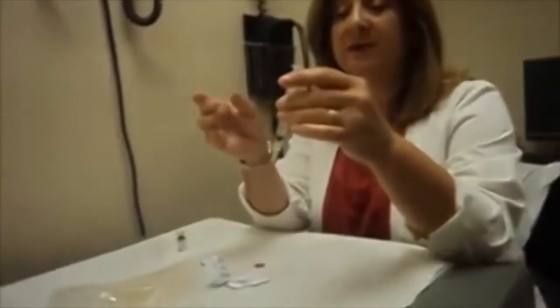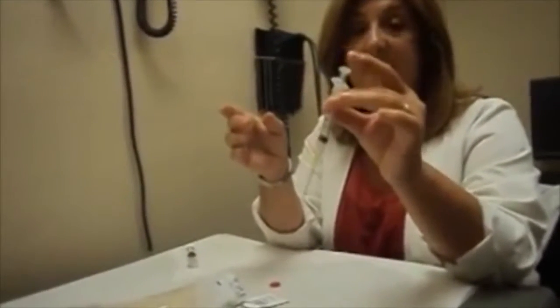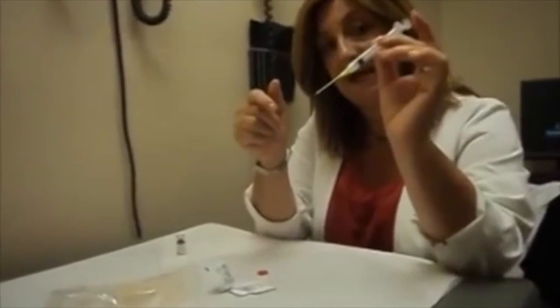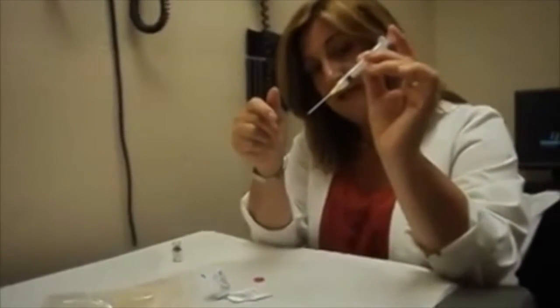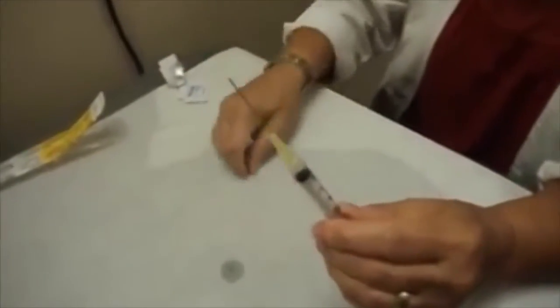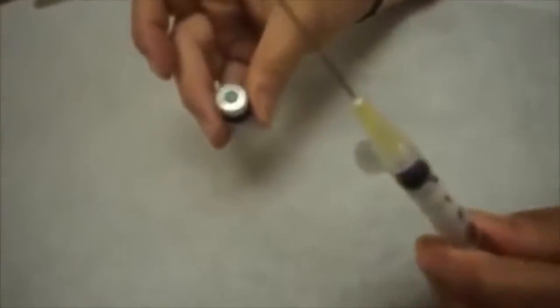When you're holding a syringe, basically I just like to use the dart method. I have it between my thumb and my second finger, and then I have my first finger ready to press down on the plunger as I need to. The air is injected into the bottle, and the simple way to do this is just hold the bottle on a surface, put the needle in, and push the air in.